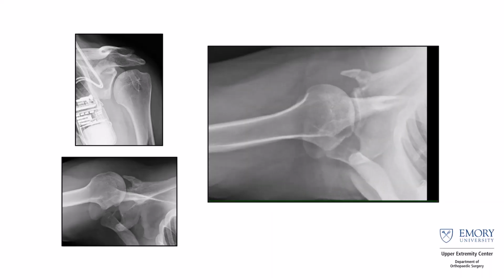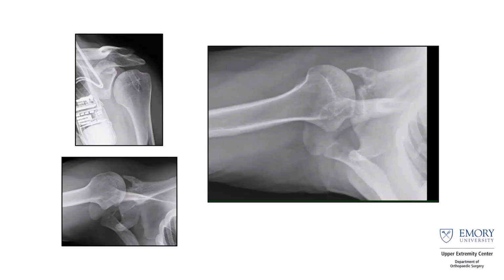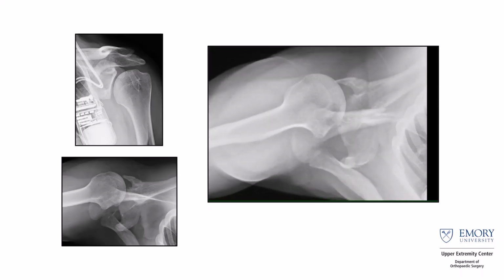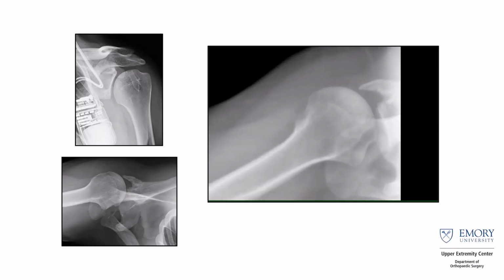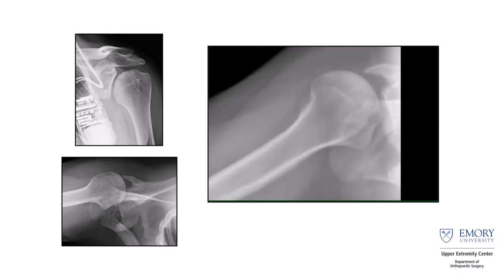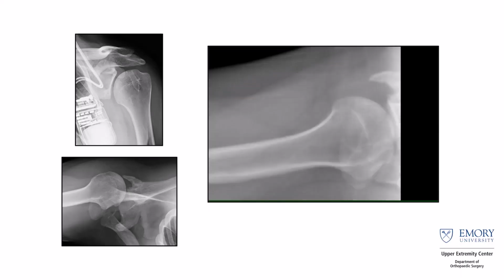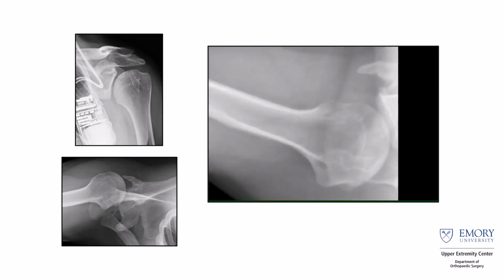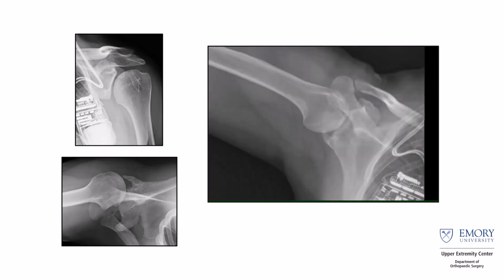So you can legitimately see his shoulder sublux from inside the glenohumeral joint and then out posteriorly, back into the glenohumeral joint and back out posteriorly where that bony Bankart is. So you can see on these multiple views how his joint is legitimately subluxing from inside the glenohumeral joint out posteriorly to where that prior bony Bankart was from, probably one of his 100+ dislocations.